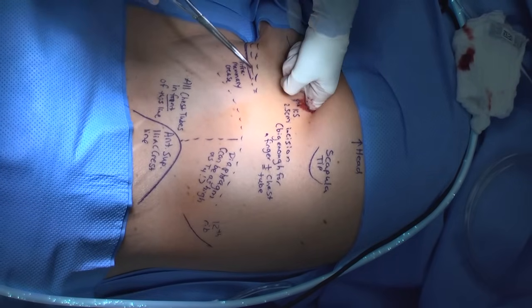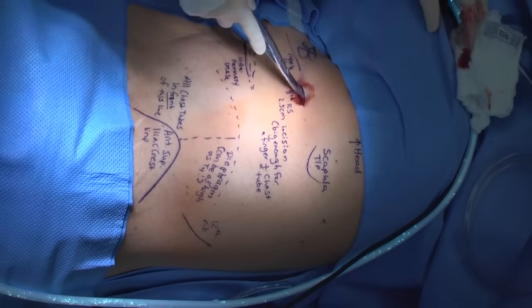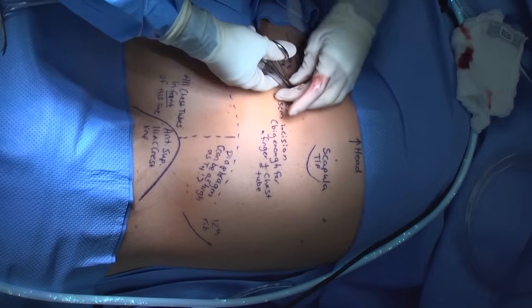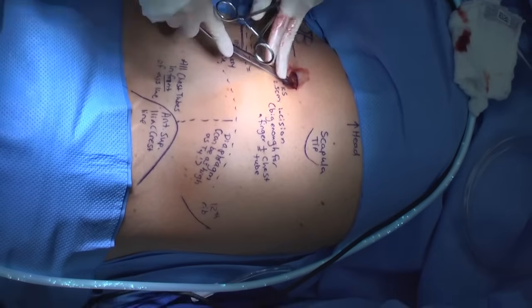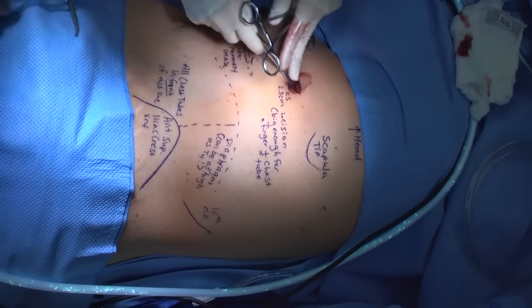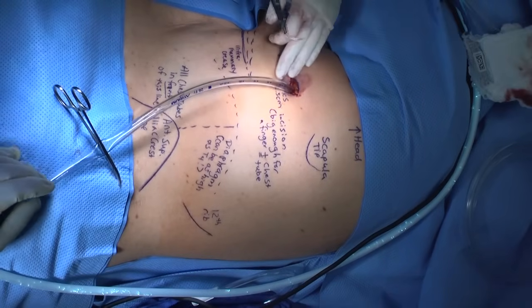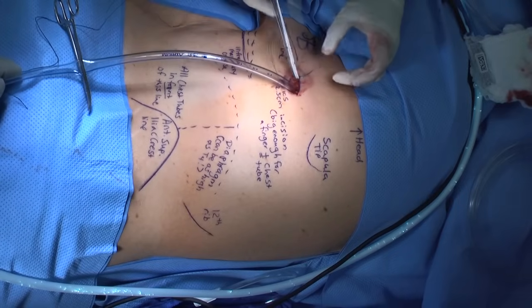Perform a finger sweep to confirm that there are no adhesions. Insert the chest tube using a Kelly clamp or your finger to guide the tube into the desired location — apical for air, posteriorly for fluid, or into the specifically desired collection. In an awake patient, the finger can be very helpful in directing the chest tube away from the fissure and keeping it along the chest wall.